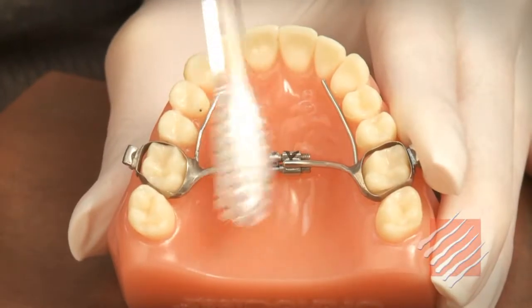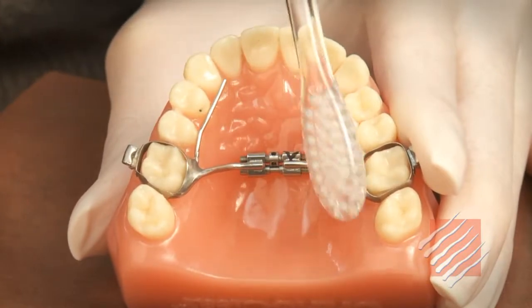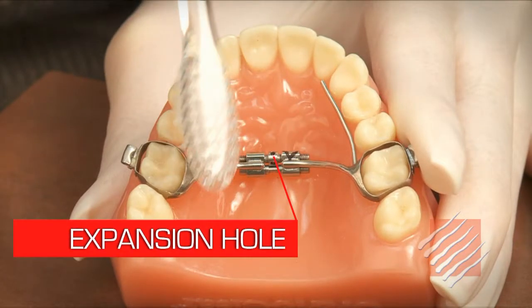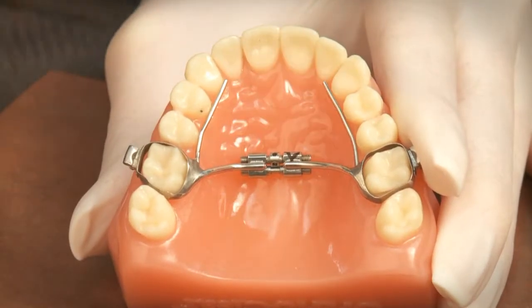Another very important thing to remember about your expander is that you need to make sure to keep it very clean, which you can do by simply brushing it with a toothbrush. If you don't keep it clean, the expansion hole can become clogged with food and plaque, and then it may not be visible at all to the person who needs to get in there and help you turn it.